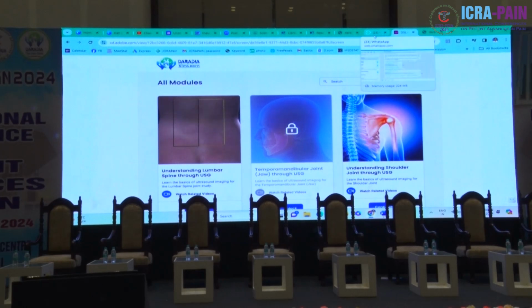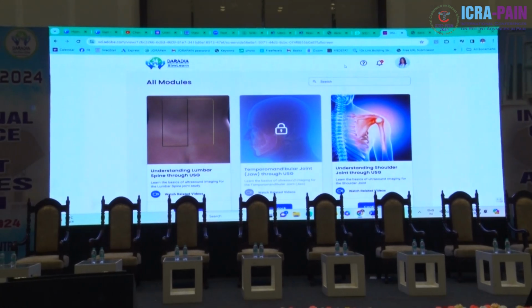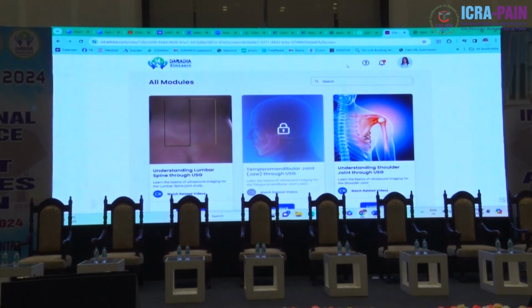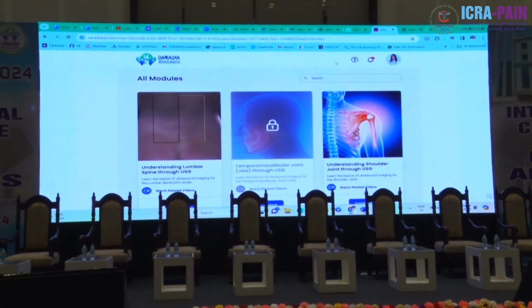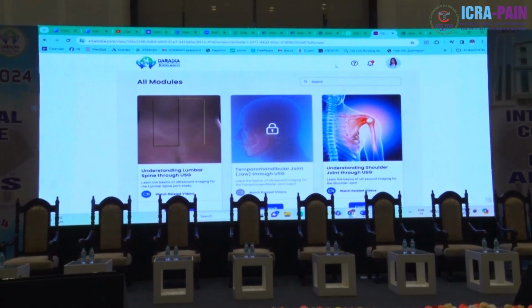So it's not really coming back to the home. Once you go back and if you write HTTP colon slash slash and don't add the S, then we can show you a little bit more of the features. Otherwise, I am sitting down here. Anybody can come over and see it on my laptop, and then I can show you how you can access it in yours.